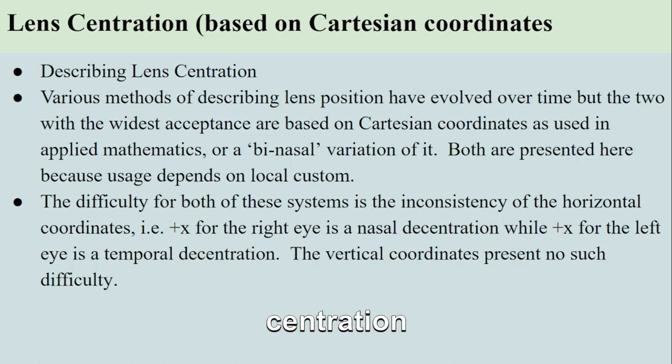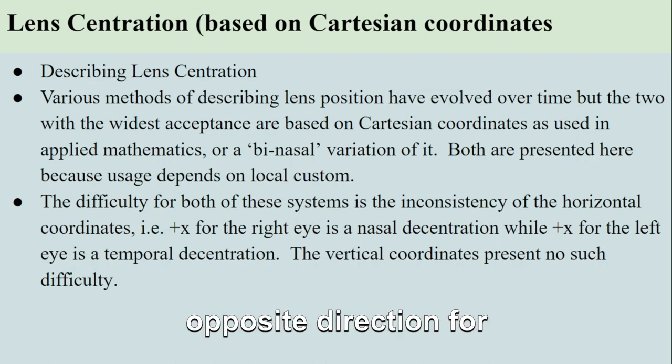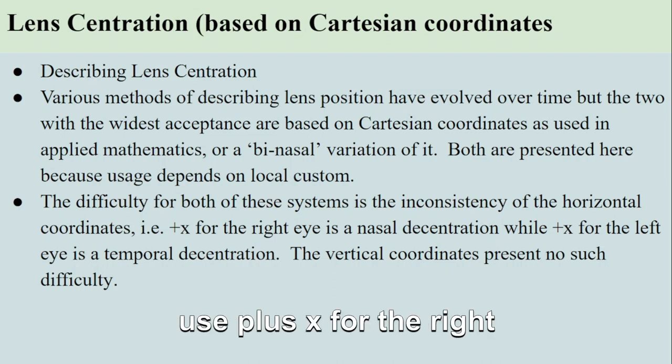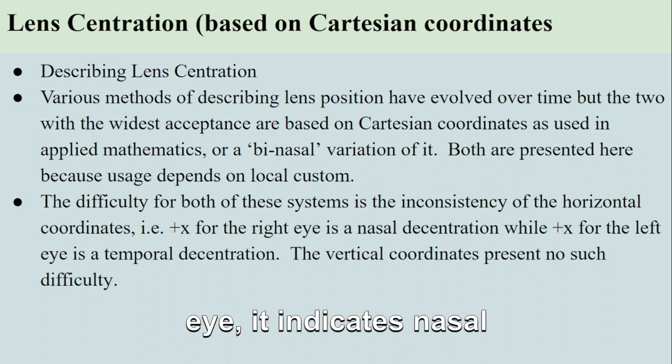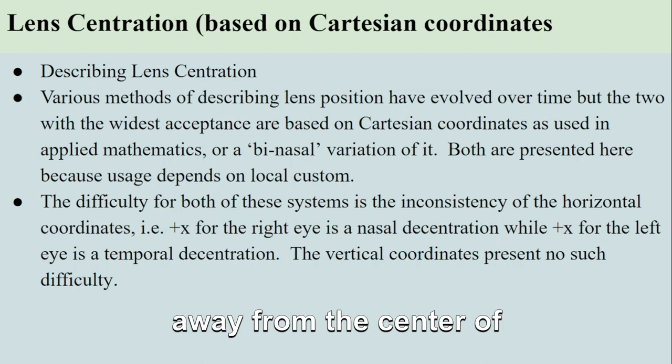In lens centration, the vertical axis is used to describe the lens position without any difficulty. However, with the horizontal coordinates, an inconsistency arises because the right eye and left eye have opposite directions for the horizontal coordinates. In other words, when we use plus X for the right eye, it indicates nasal, towards the center of the face, decentration, whereas plus X for the left eye represents temporal, away from the center of the face, decentration.